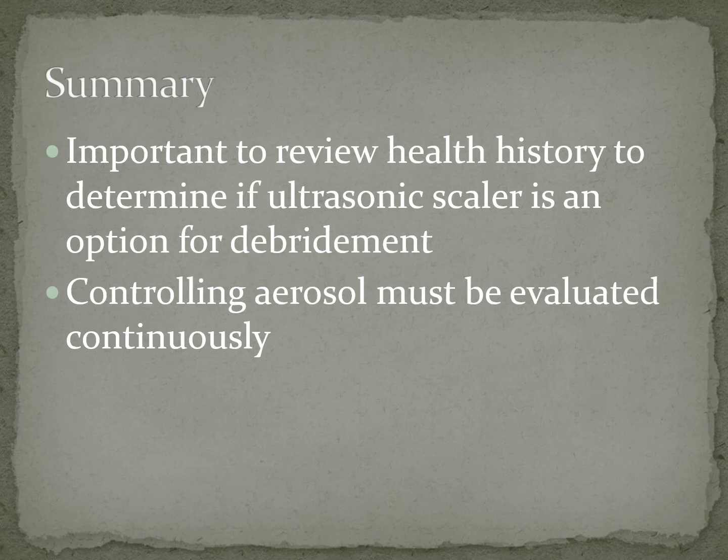All right, so it's important to review the health history so we can determine if we are even going to use the ultrasonic scaler or not. And we definitely have to make sure that we control those aerosols. So we need to keep ourselves safe, we need to keep our patients safe, we need to keep other patients safe in the clinic. But using the ultrasonic scalers is going to make it a lot easier with our difficult patients, and it's going to help our patients stay healthier.